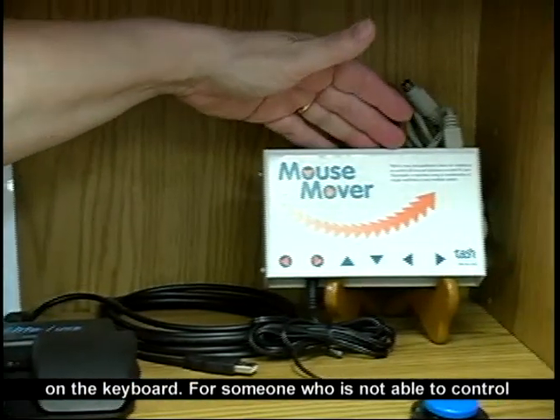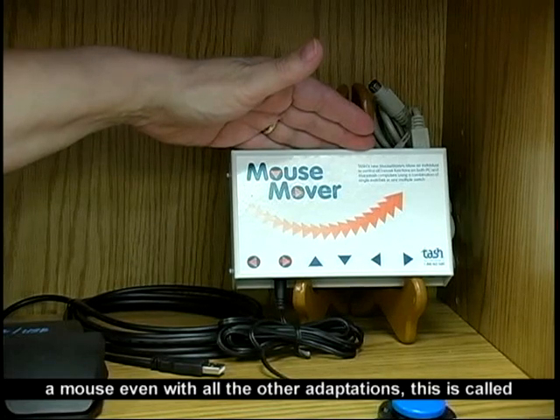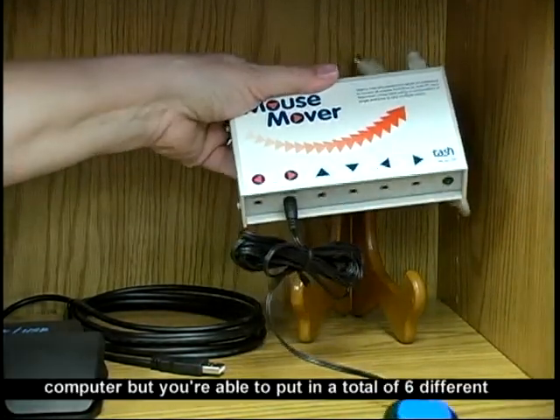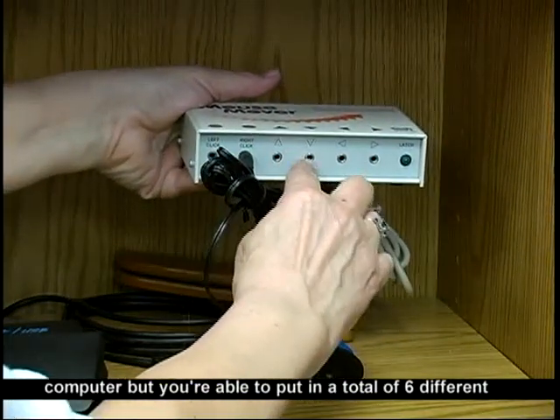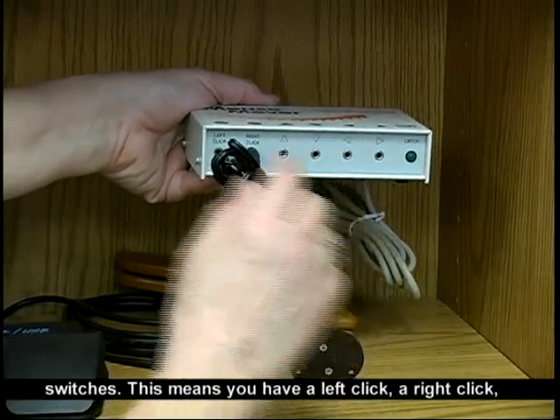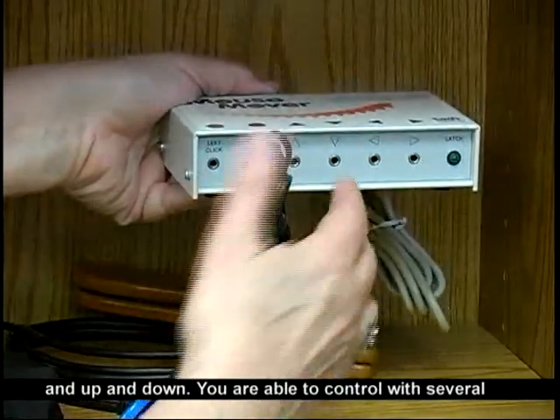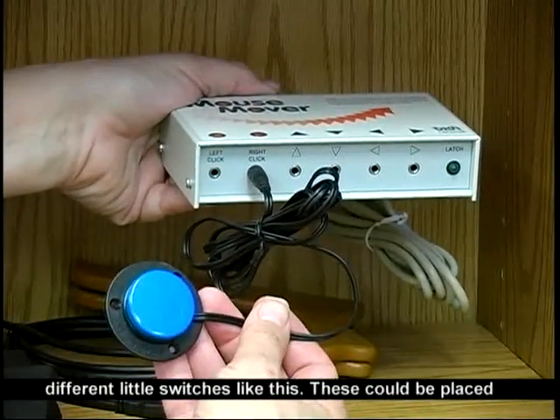For someone who is not able to control a mouse even with all the other adaptations, this is called a Mouse Mover by Tash. This one you plug into your computer, and you're able to put in a total of six different switches. This means you have a left click, a right click, and up and down — you're able to control with several different little switches like this.